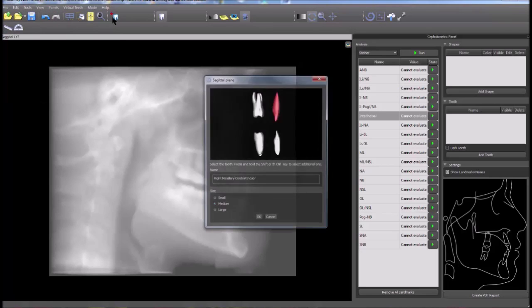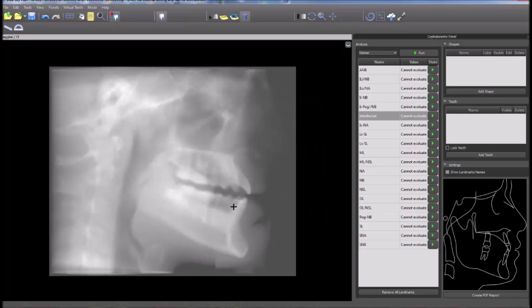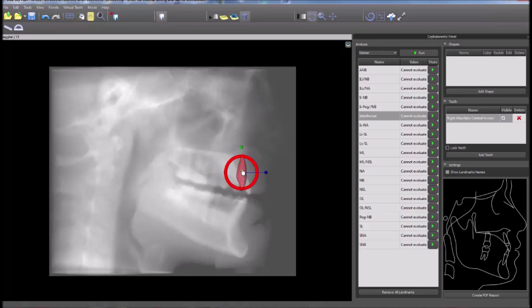Teeth can be added by clicking on the add tooth icon on the toolbar. Select the relevant tooth, size, and click OK. Left click to affix the tooth to the image and position and rotate as necessary by using the built-in widgets.